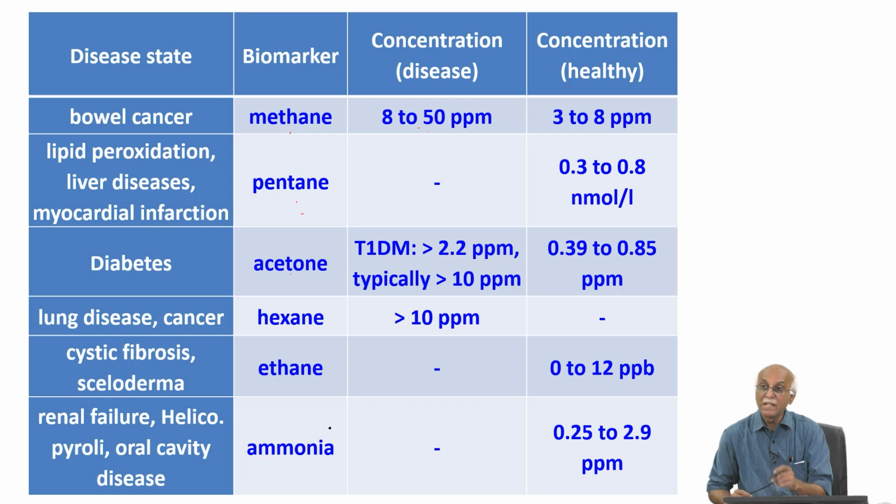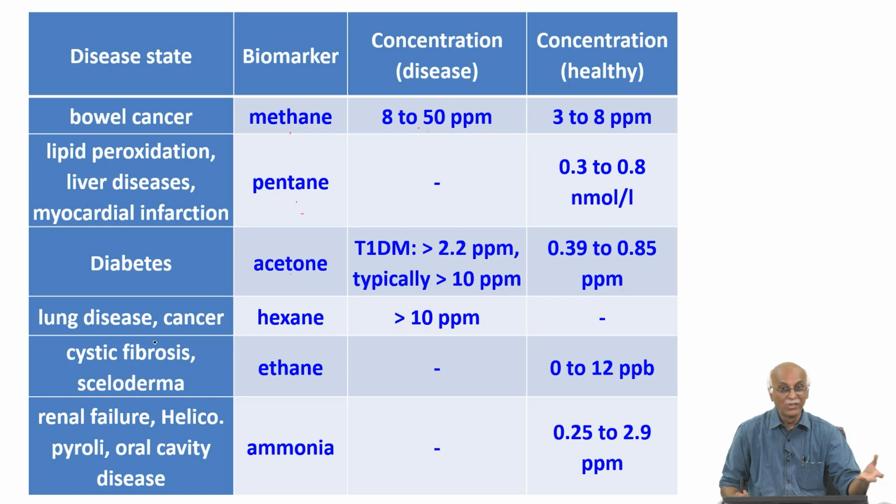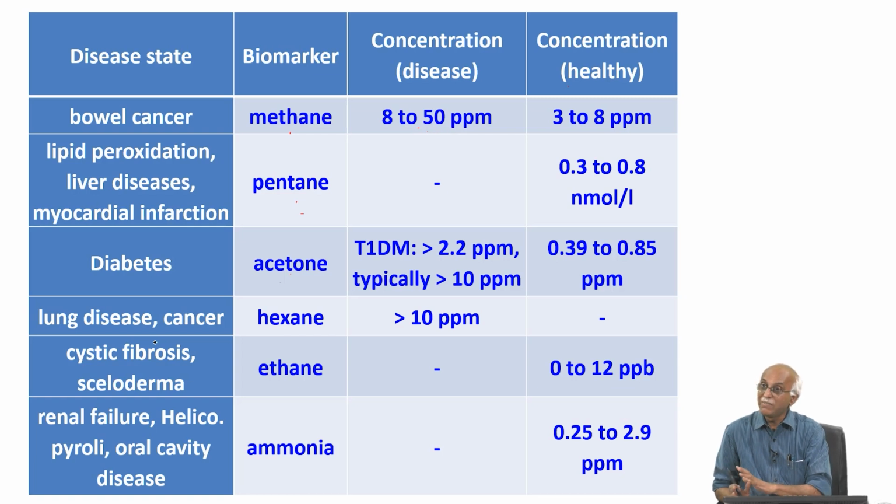However, how do we measure such trace gases, such biomarkers, is the real challenge. If we can measure from human breath, then we need not worry about biopsy etc. While we remove the tissue, go for analysis, remove the blood sample and take it, if we can implement some idea in terms of clinical measurements of human breath, then it is a very good non-invasive approach to extract the information.